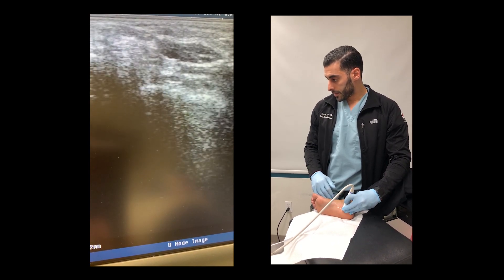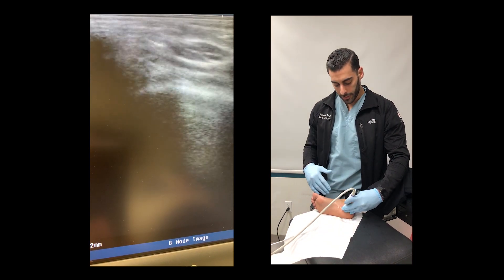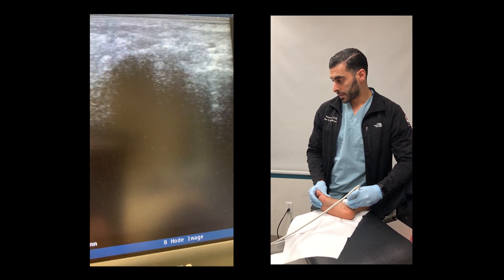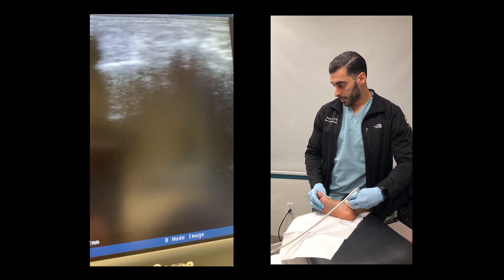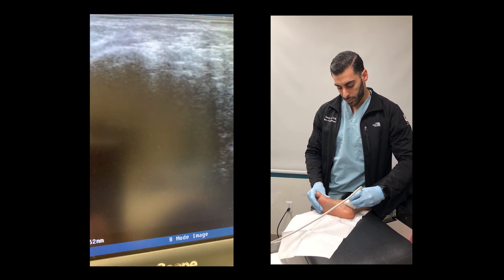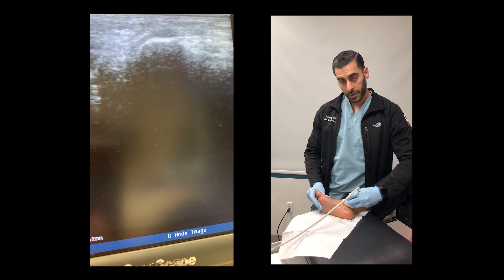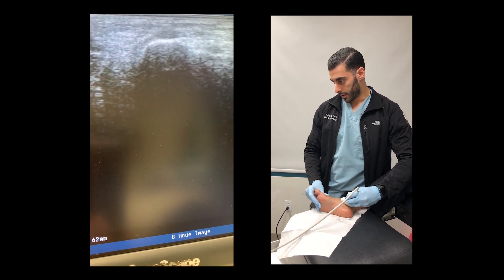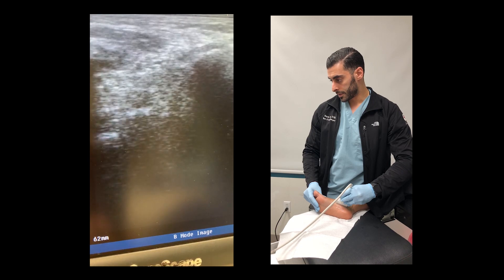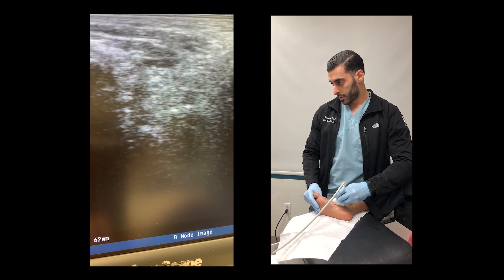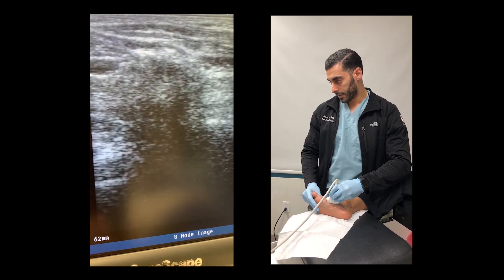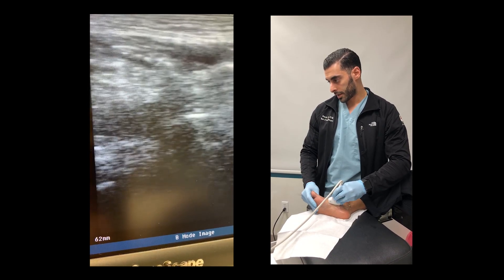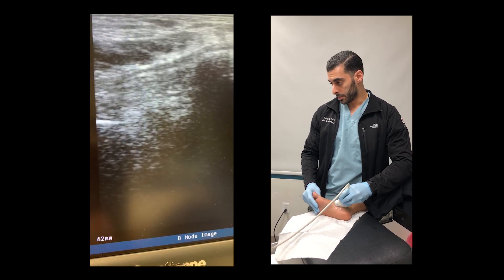There you can see it, and if you see any pathologies we'll explain later how those will appear. Going on the long axis, we'll trace the posterior tibial tendon — there you can see it again hugging up against the tibia. Orientation is especially important for this view because with just a little bit of rotation you may or may not see it. We trace the tendon right into the insertion and then trace it back, and with this patient everything appears to be normal.